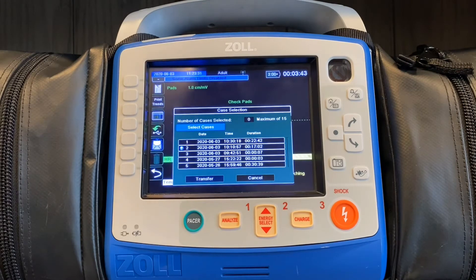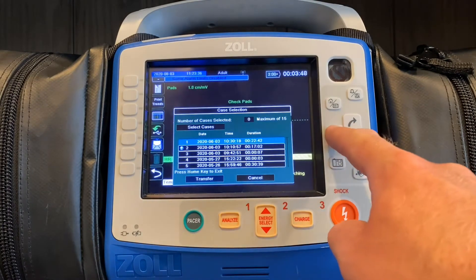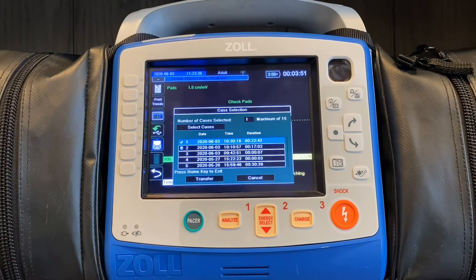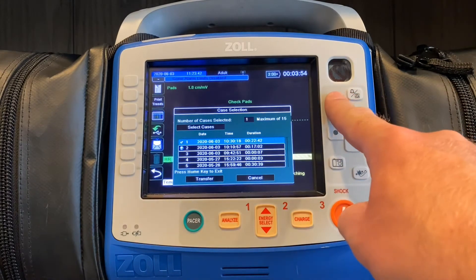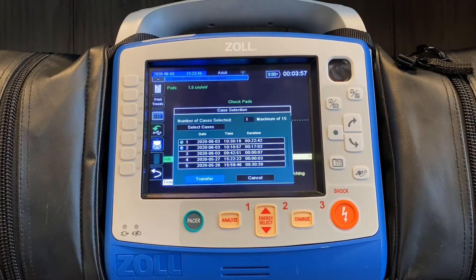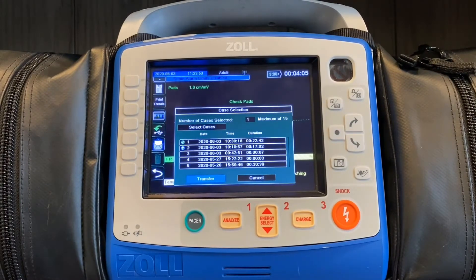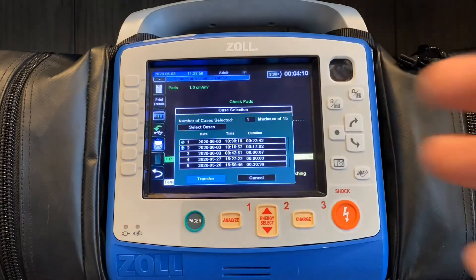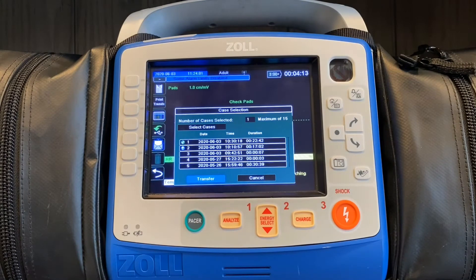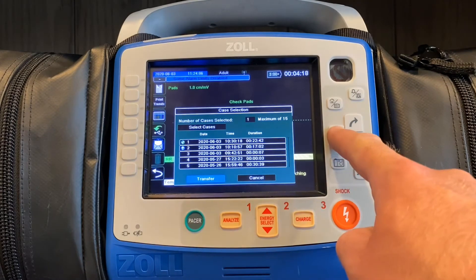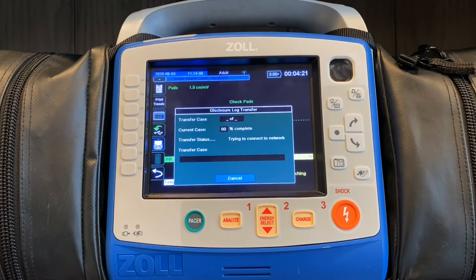The steps are hitting enter — that'll drop you down into the list of calls. Select which call you'd like; you can select a maximum of 15 calls. You then hit the home button, and transfer will be lit up. So the next step is going to be to transfer this data. This is contingent on having some sort of connectivity to the internet, whether that be Wi-Fi or a cellular connection. You just want to make sure that you have some sort of available internet connectivity. In this case, I'm going to hit transfer.